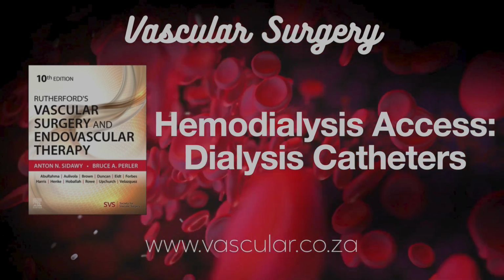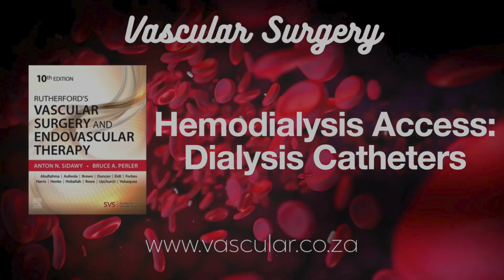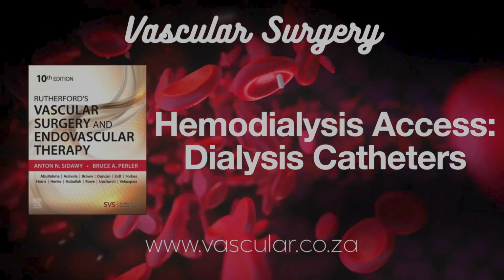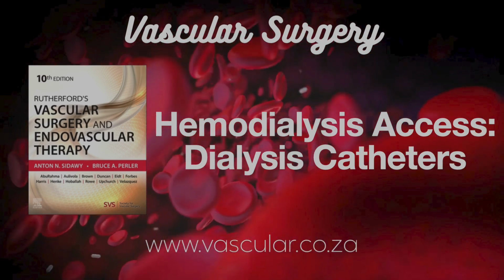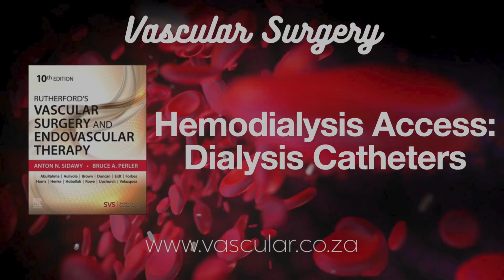So what do you do when it does get blocked? Often, the first step is trying a fibrinolytic agent, like alteplase. Instill it into the blocked lumen, let it sit for a couple of hours, then try to flush. Can repeat if needed. Often works, at least for a while. Only temporary sometimes. Yeah, might only buy you a few more dialysis sessions before it clogs again.